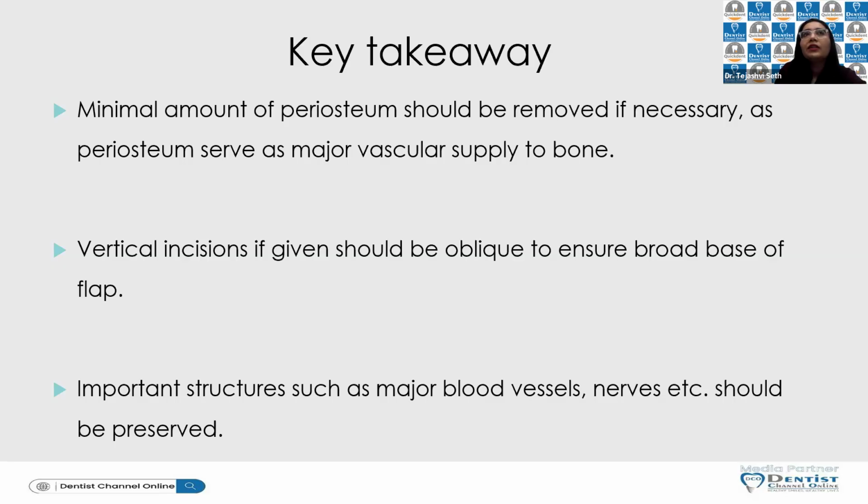See, when we are placing an implant, we are continuously irrigating it, so you don't want your bone to be heated. But then you have to think about the soft tissue also. That also helps your bone healing. Your periosteum actually helps your bone to heal.